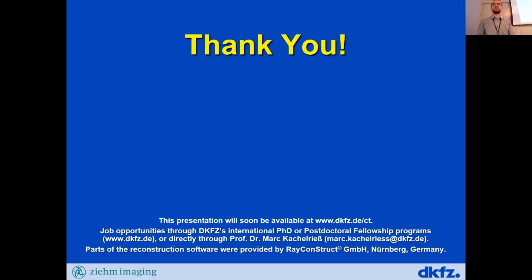Thanks for the interesting talk. I just have a question. For the reconstructed image volume, are these binary or are you reconstructing gray values as well? The target is binary, but the last layer of the DeepTool reconstruction is a sigmoid layer. So in principle, it can output any value between 0 and 1. But in practice, we see that the network almost always outputs exactly 0 or exactly 1. There's not much in between. So it's quasi binary, I'd say.